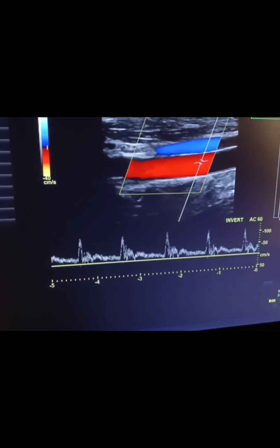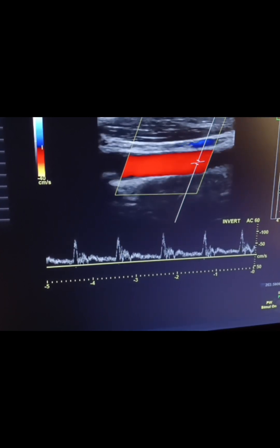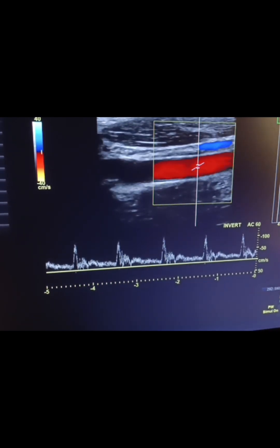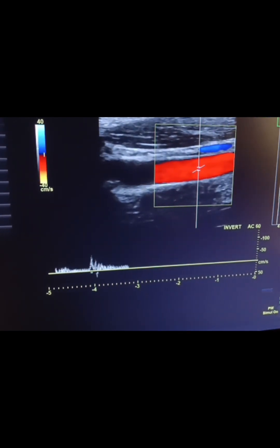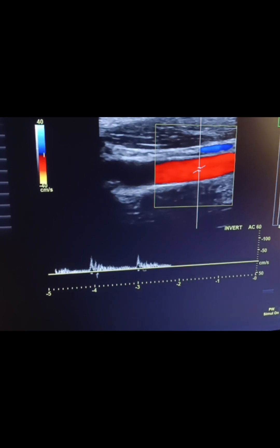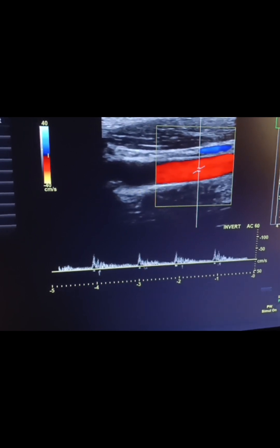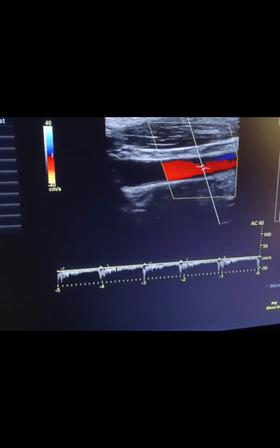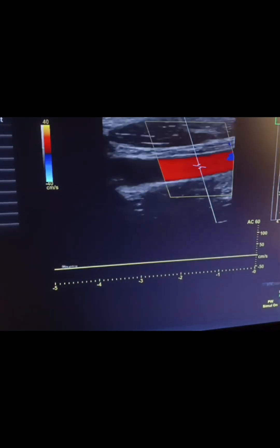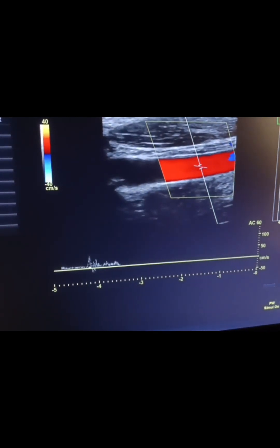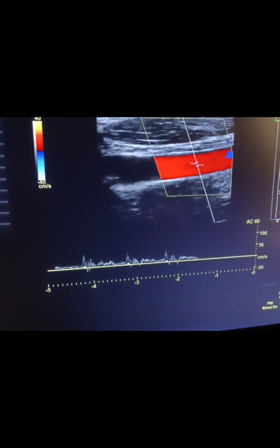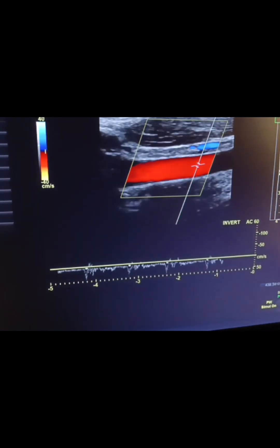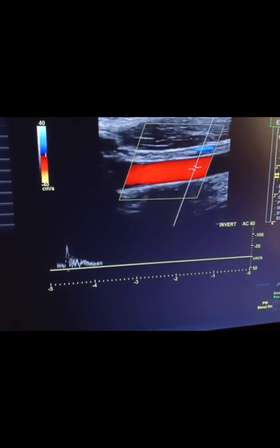Another thing: if I am scanning and this is nice and parallel, but if I have it steered incorrectly, watch what happens to that waveform — you can see it dampen. I've lost my spectral window and velocity looks abnormal. If I steer it incorrectly the other way, again crappy velocities and I lose my spectral window. It is very important that you have it steered correctly, nice and parallel. That looks good.